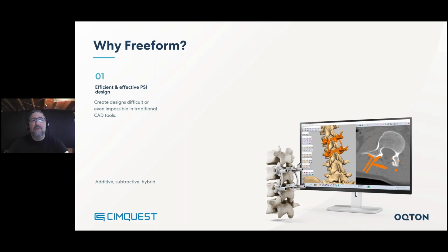We've had customers who have tried many solutions. We've had them report that sometimes they have difficulty with it, and sometimes they can't even achieve what they're looking to do. Freeform removes some of that, and we have actually had a customer once upon a time who requested a demo, and they gave us 3 cases to do.